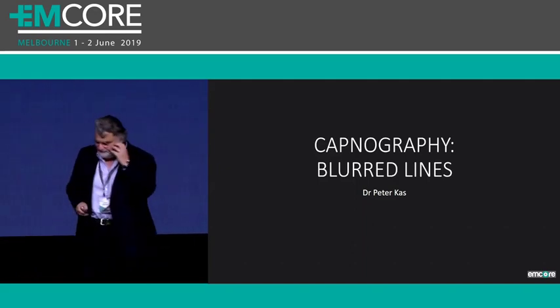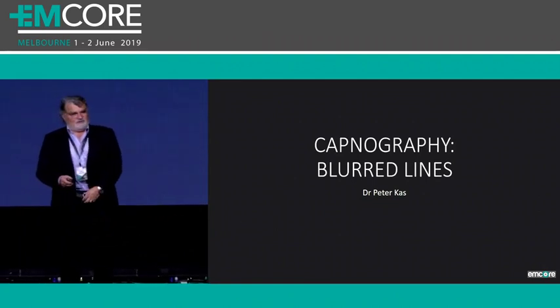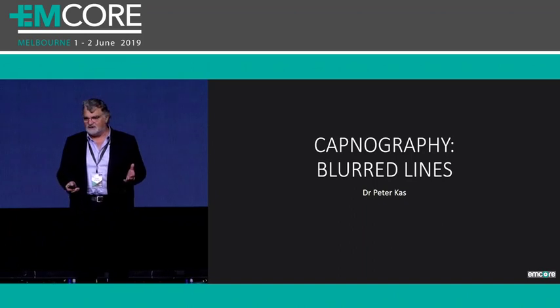Capnography. All right. To me, capnography is like a sort of encrypted, weird thing. You know, it's like candlestick graphs for share prices. I could never understand it. But it's quite simple and you can use it to your advantage.